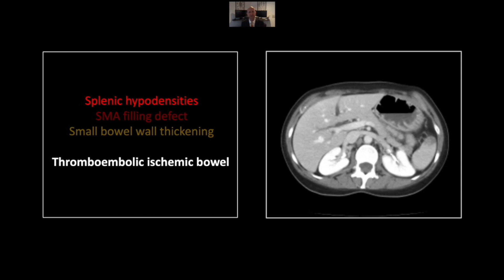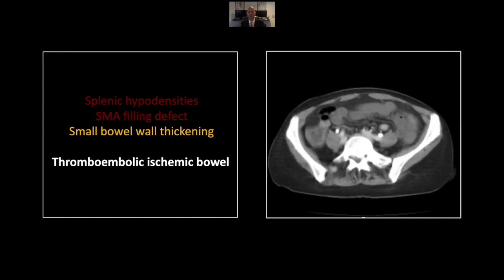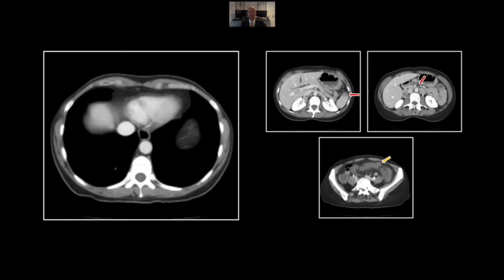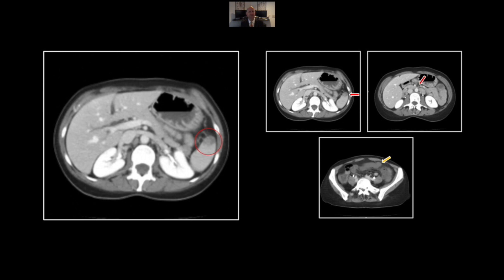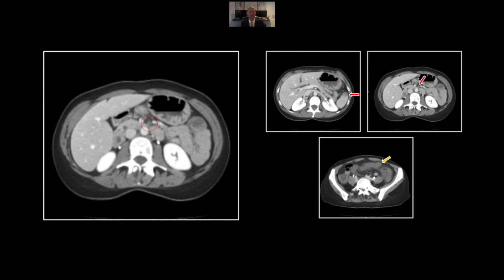Our next case is a thromboembolic ischemic bowel. The key here is this splenic hypodensity — it's peripheral, it's well circumscribed, it is a classic microembolic infarct. That should set you looking more distally, where you can see the superior mesenteric artery is occluded with thrombus. In the pelvis, there is significant thickening of the small bowel wall with stranding, suggesting enteritis — in this case, obviously ischemic. Here again, the peripheral hypodensities in the spleen. Follow that SMA; there you see its occluded segment.